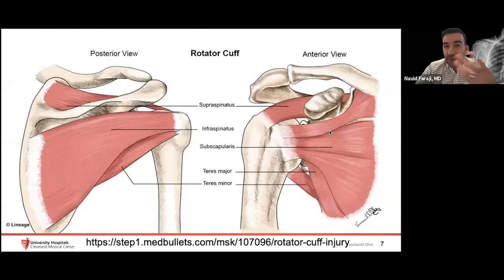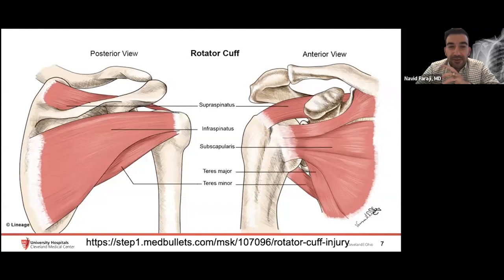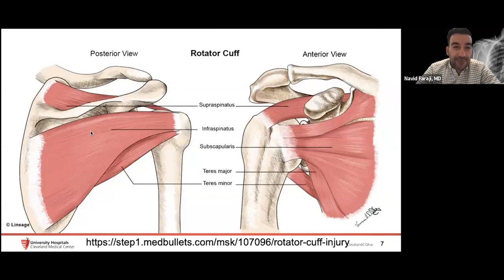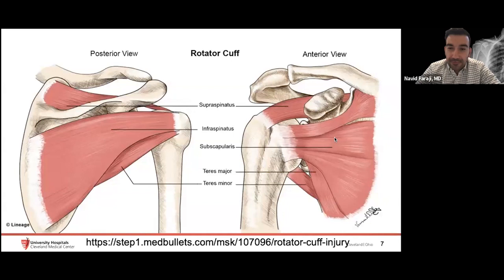The subscapularis is appropriately named — it sits on the under or anterior surface of the scapula. It has a multi-pennate muscle and tendon architecture, which is different from the rest of the cuff. The teres minor is the remaining one — it's inferior to the infraspinatus. In summary: supra is above the spine, infra is below the spine, teres minor is below infra, and these are all posterior/dorsal structures. The subscapularis is the ventral multi-pennate muscle-tendon inserting onto the lesser tuberosity.